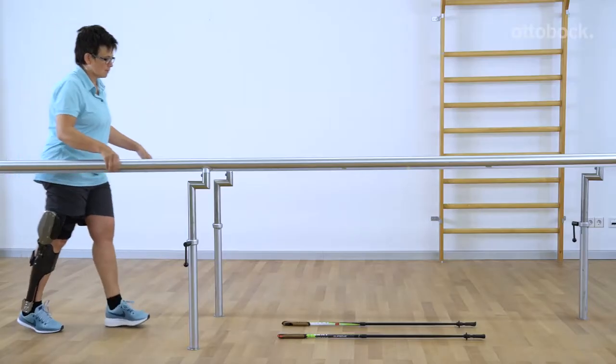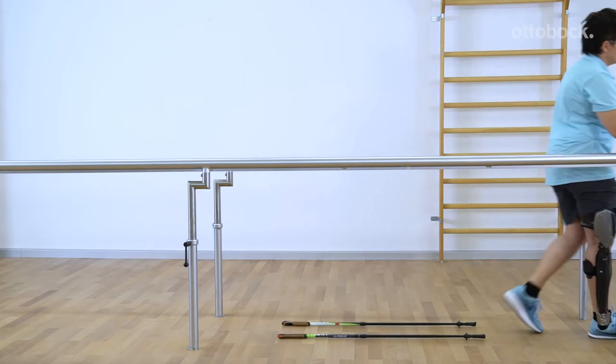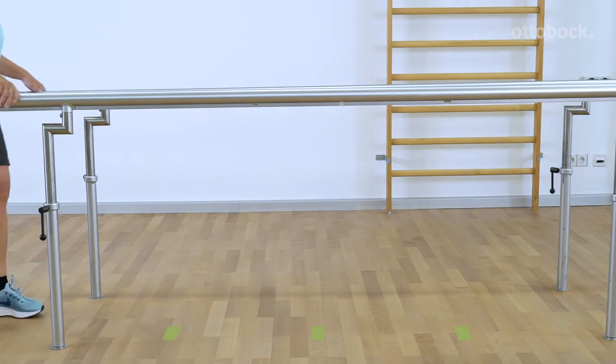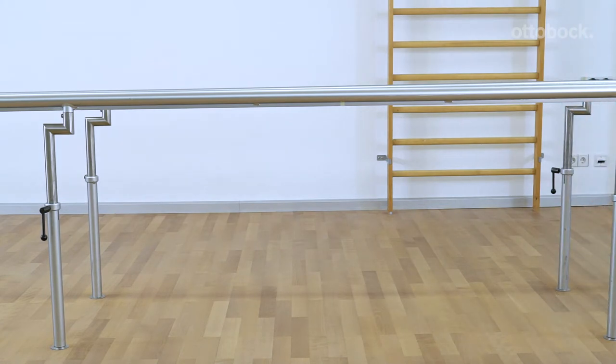Practice walking between two ropes, sticks, or strips of tape on the floor. If the stride length is very irregular, marks on the floor can be used for visual support. A metronome or music are also helpful for developing an even walking rhythm.